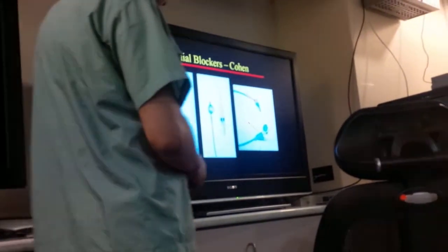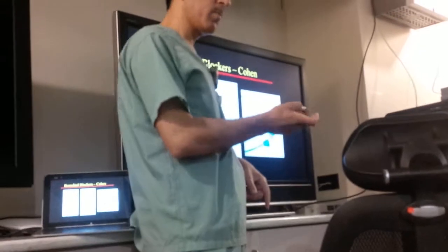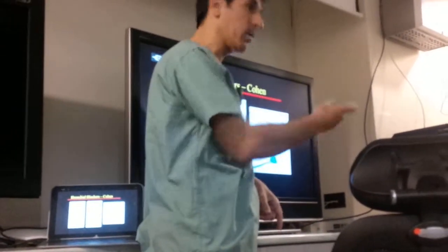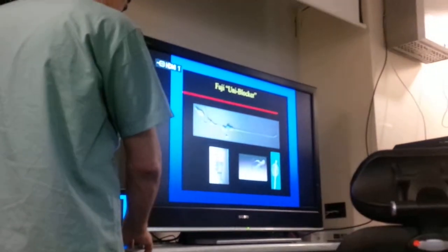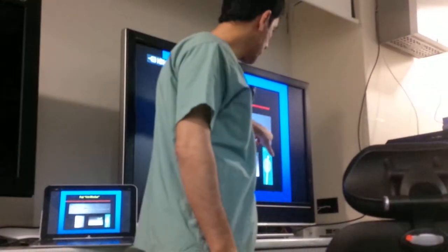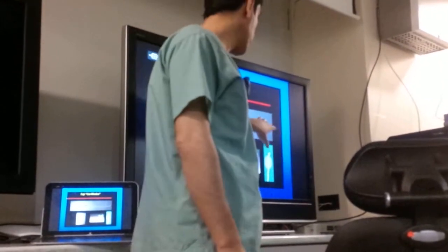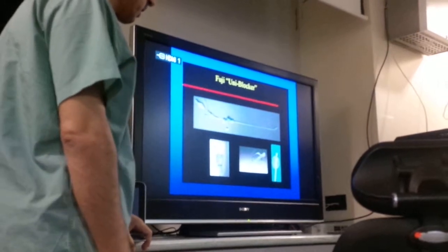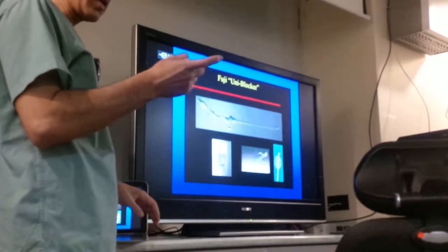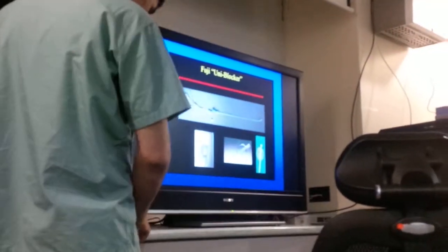This is Cohen. Cohen has a wheel here outside, so it flexes the tip, anterior and posterior, then you can manipulate the tip. Fuji is already flexed like the Univent, so we can manipulate it. It just came from the cath lab. If anybody works with cardiac patients in the cath lab, you see their catheter has a tip like this. They can manipulate it wherever they want.